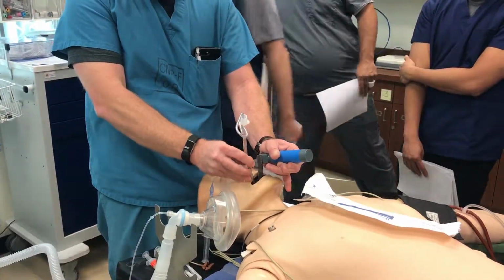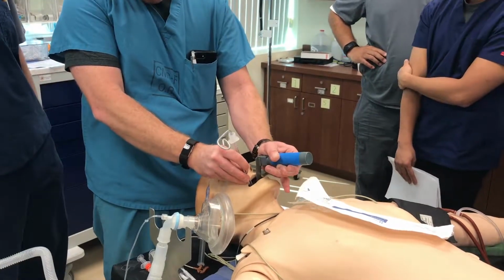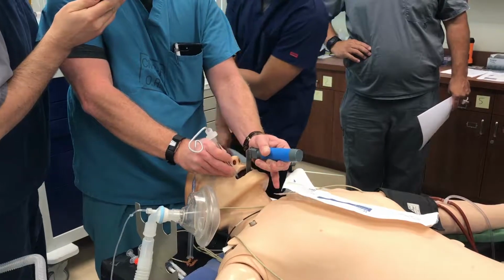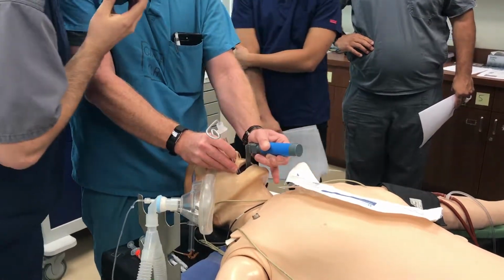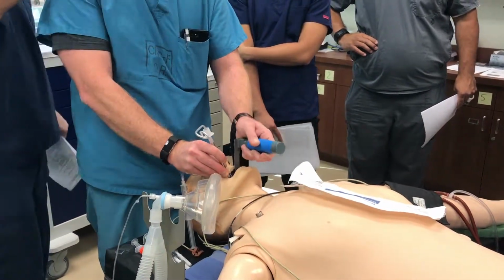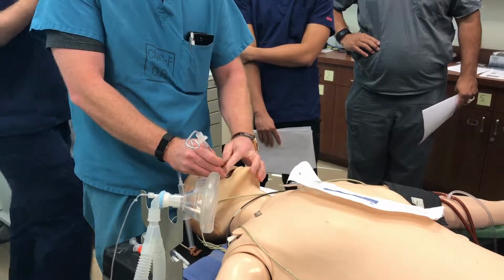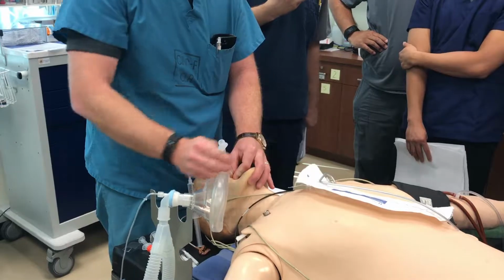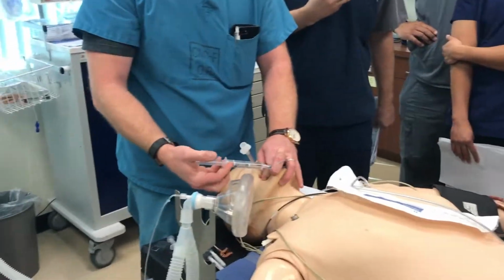See my inlet. I don't know if you can see it. That's fine. The cuff is going right past the vocal cords right there. Yep. Okay. We don't need this anymore. Shut that. I'm holding here at the corner. Pull out your stylet. Try not to bend that to hell.